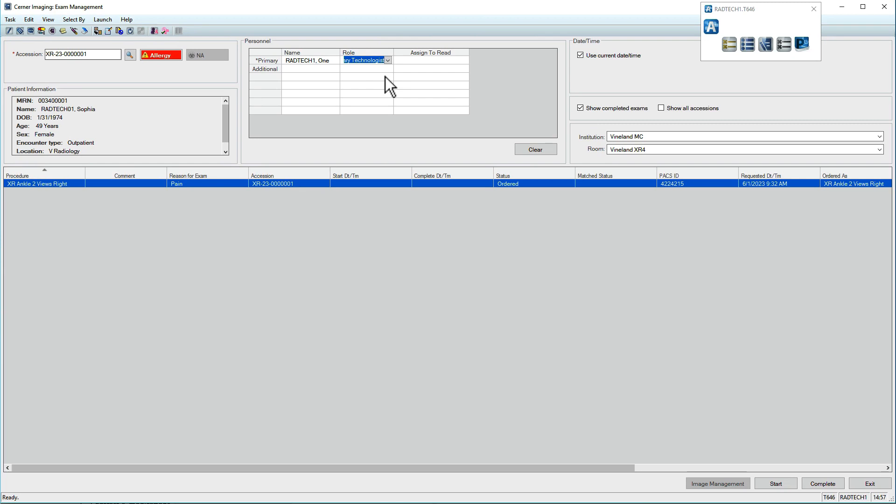In the upper right, ensure Use Current Date Time is checked. If needed, another time can be specified.